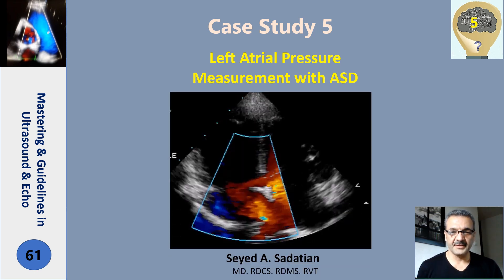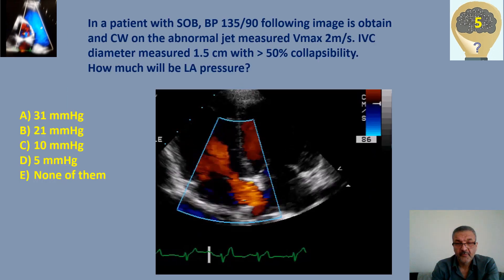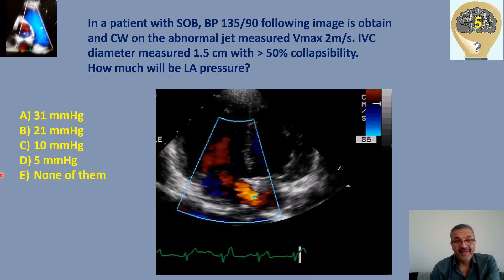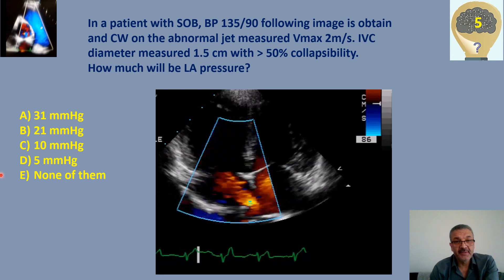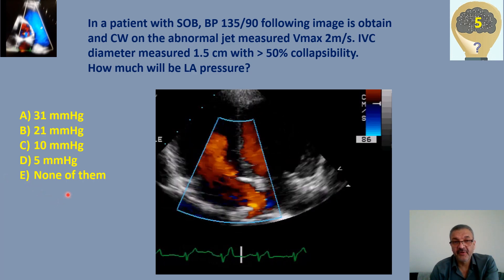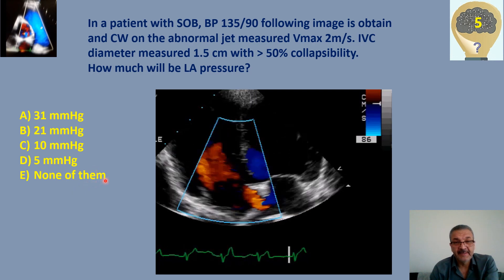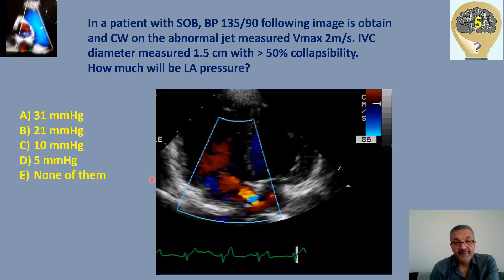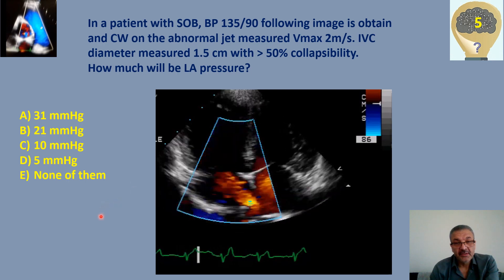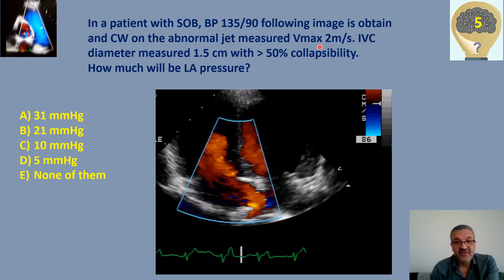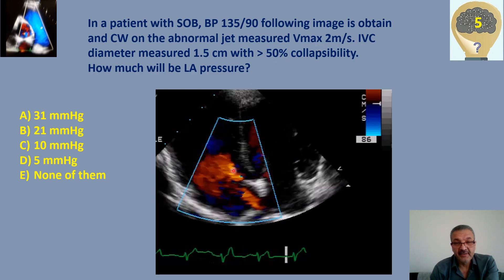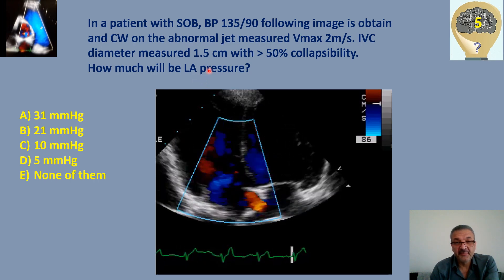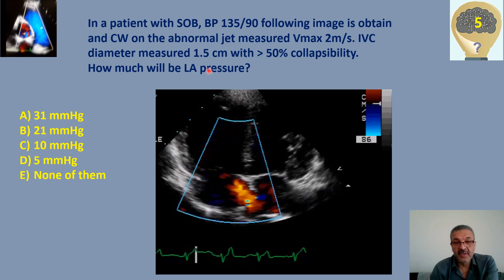Welcome to Mastering Guidelines in Ultrasound and Echo. Here we have a case: a young patient presenting with shortness of breath and blood pressure 135 over 90. On echo, we obtained this view and placed continuous wave Doppler on the jet, giving us a V max of 2 meters per second. IVC measurement was 1.5 centimeters with over 50% collapse.